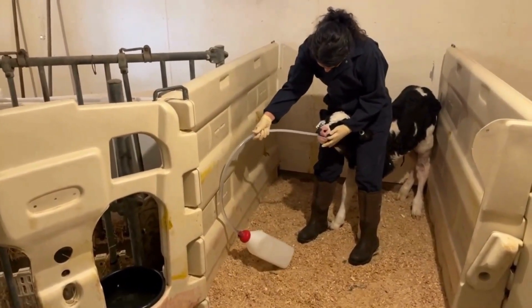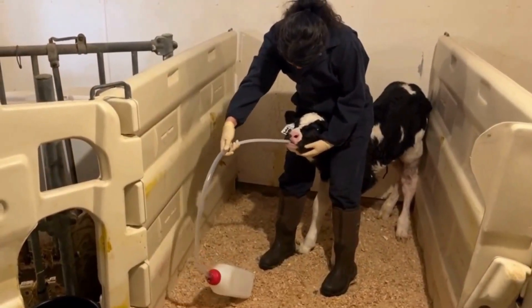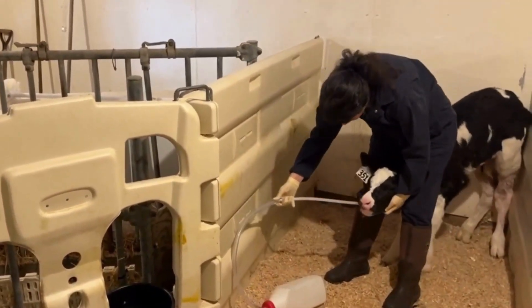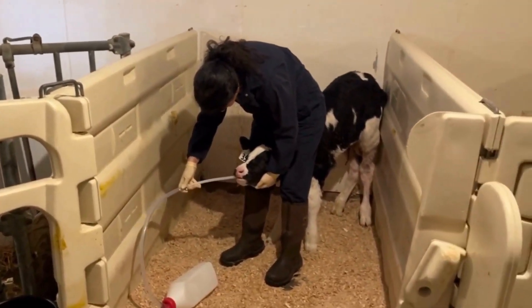With the calf's head slightly up, slowly and gently insert the tube over the tongue towards the back of the mouth, aiming for the left side of the throat. You can try to stimulate the calf to swallow. The tube should pass smoothly.